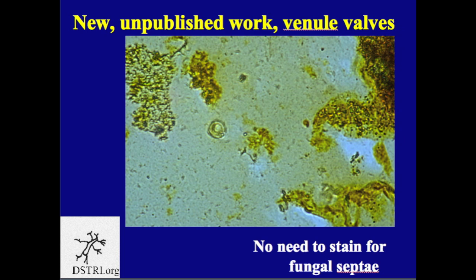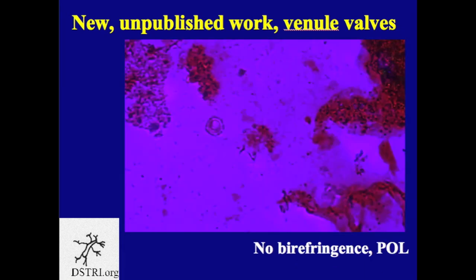It's not a fungus, and so we will not stain for the septi which we did previously. Here is the same image now under polarized light, and you can see that there's no birefringence in the vein valve. Therefore it is not calcified and it is not a woven fiber. So it is not a fungal hyphae, it's not a woven fiber, and it's not calcified. It is still a piece of soft tissue. We're going to stain it with other stains so you can see other characteristics of these vein valves.